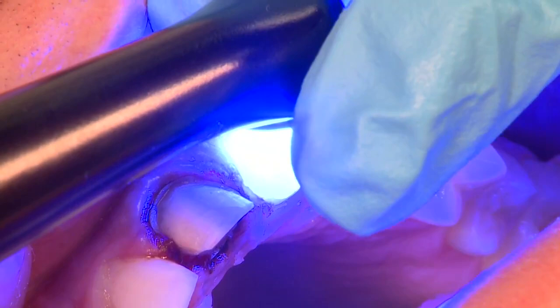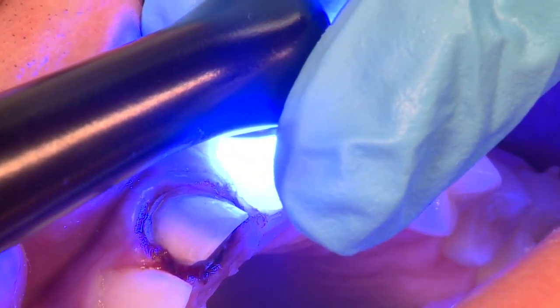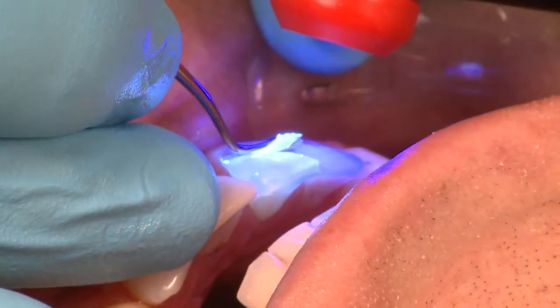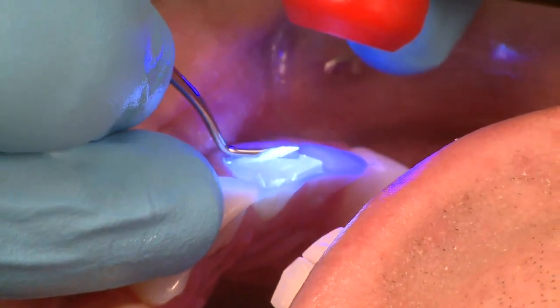Upon definitive cementation, one simply hits the surface with a black light to assure that all of this clear provisional material is removed prior to definitive cementation.